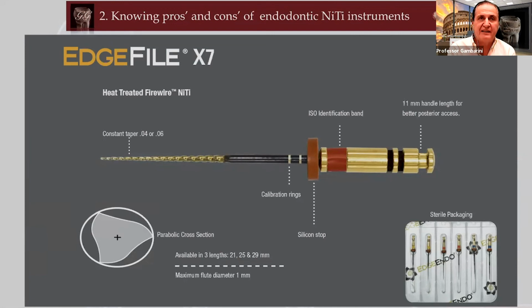So what is very important in endodontics is to clean the canal. But we have to understand that people always speak about cleaning the canal, but they don't speak too much about producing debris. There are some instruments, especially the ones that have bigger tapers and a longer working part, that if you don't use in very small steps, but keep on going in and in, you create a lot of debris, much more debris than the flutes of the instrument can remove.